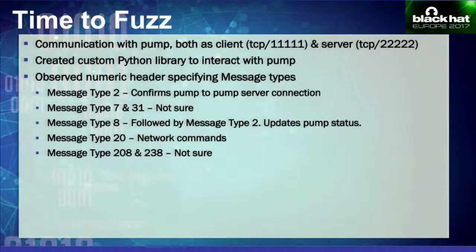Right. So after doing some back and forth, we tried to understand the request format and what the format of the response would be. Now remember, we didn't have an actual pump server on our network, so we don't really know what the request and response would look like. So we started to write Python code because it's always easy to automate stuff and then try out different inputs and outputs. So that's what we did.